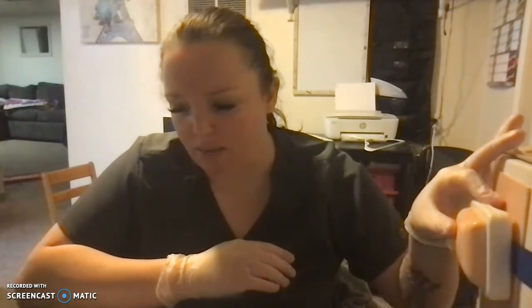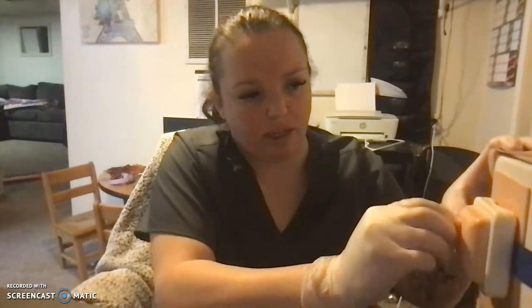When I palpate the skin, I'll make sure that there's no bruising, lesions, tenderness, or any masses. If there is any masses or anything, I would rotate to the other side to avoid the masses. And then I might also look for edema. If my patient's good there, I will use an alcohol swab, clean the patient's skin from the inside to the out in a circular motion. While I let that dry, I will then clean my top with a new alcohol swab.